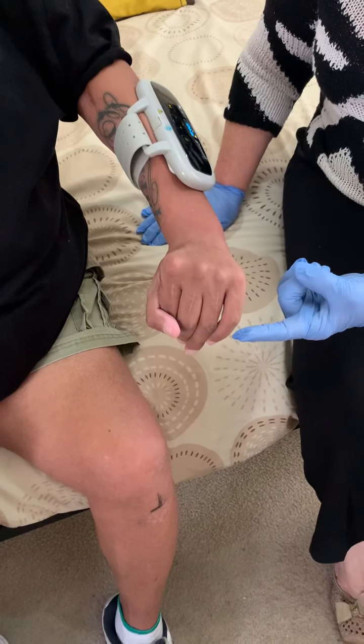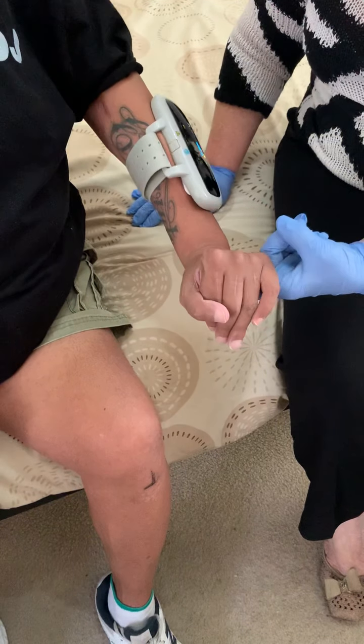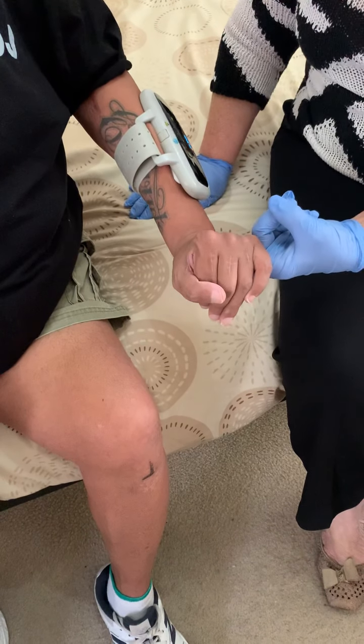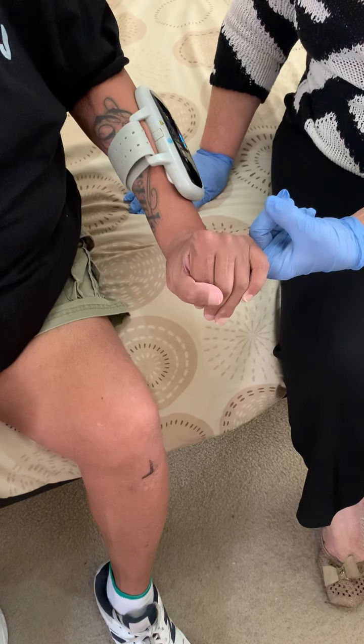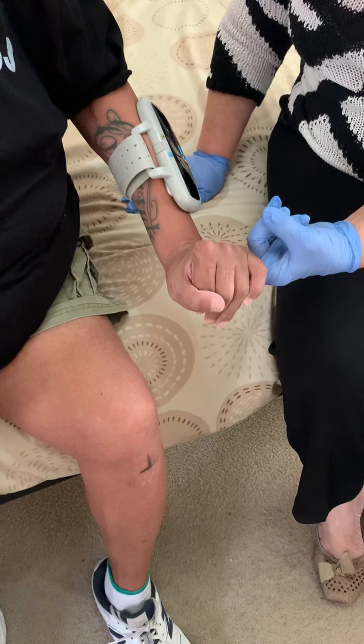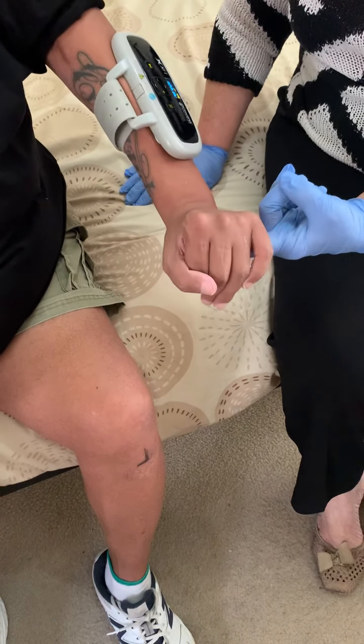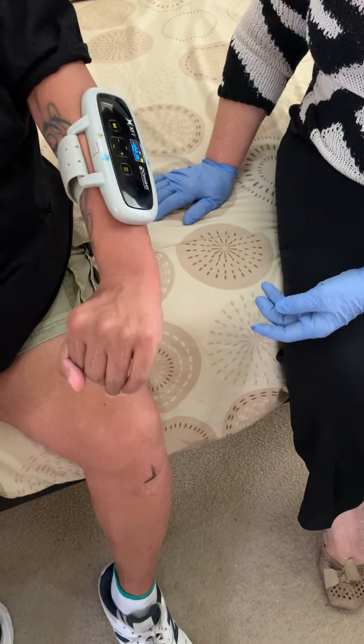Can you grab my finger? Open my hand. Grab my finger. Squeeze. I don't know if I caught it properly — you have. Squeeze it. Can you squeeze? No. Unfortunately, it hasn't come to that stage yet. It'll take a while.